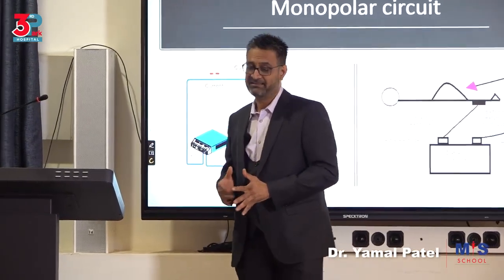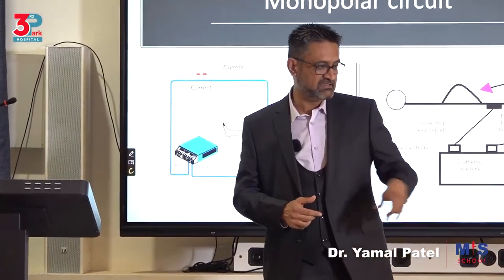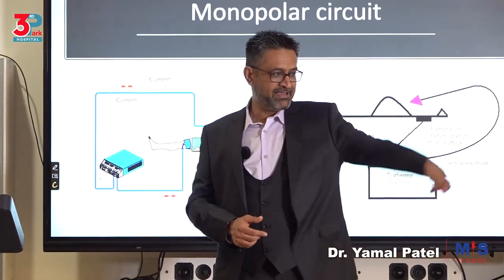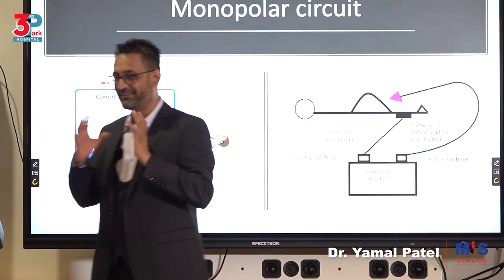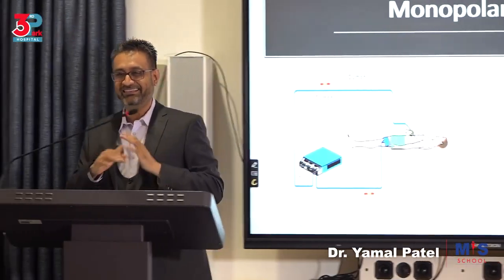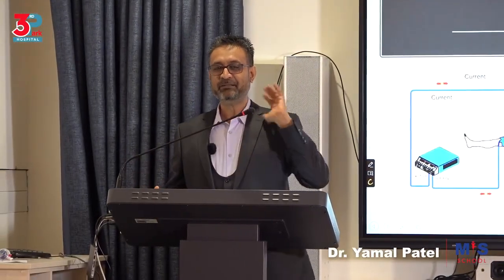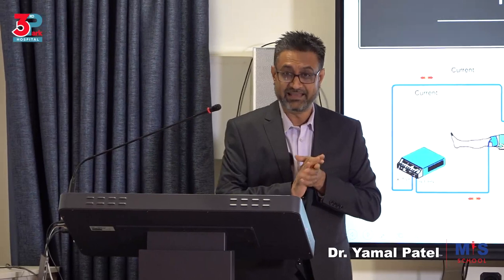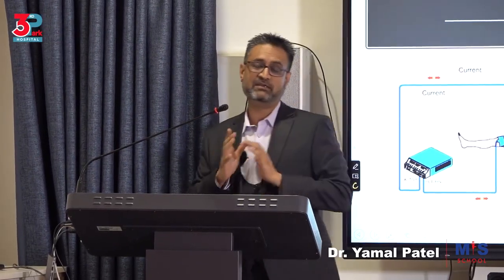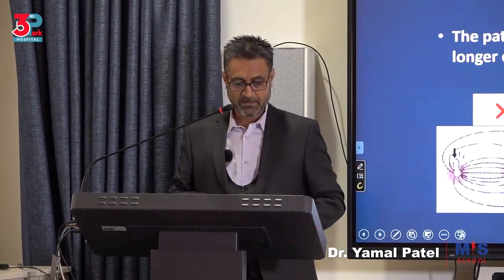And when something doesn't work, you'll see the surgeon just say, increase it, increase it. My friend, that is dangerous work you're doing. Please, that's not how energy is to be used. I think we may have some time, so we'll do some energy demo as well. I'll show you exactly what needs to be done and how.